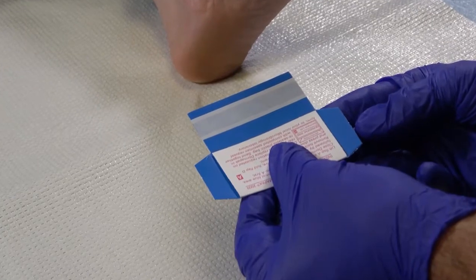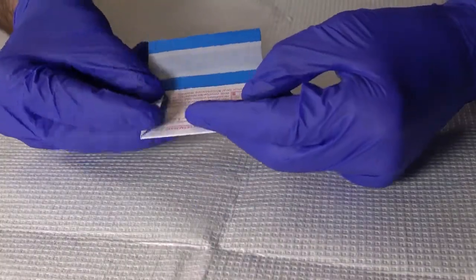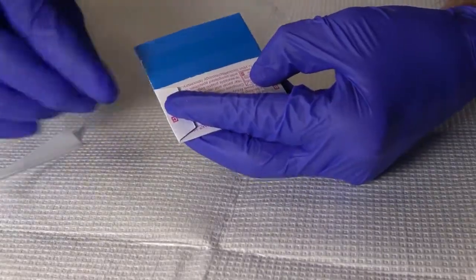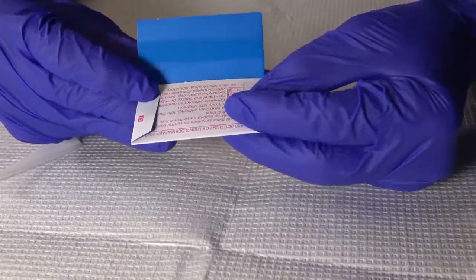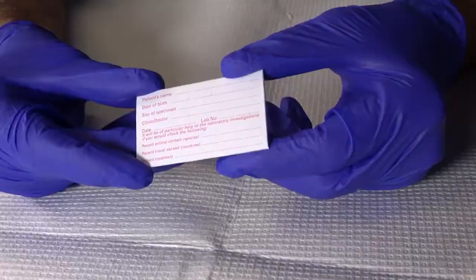Next, fold the B and C side flaps. Remove the paper covering the adhesive strip and fold flap D down, pressing firmly to ensure adhesion and closure. Complete the patient information on the rear panel and insert the collection pack back into a resealable plastic bag.